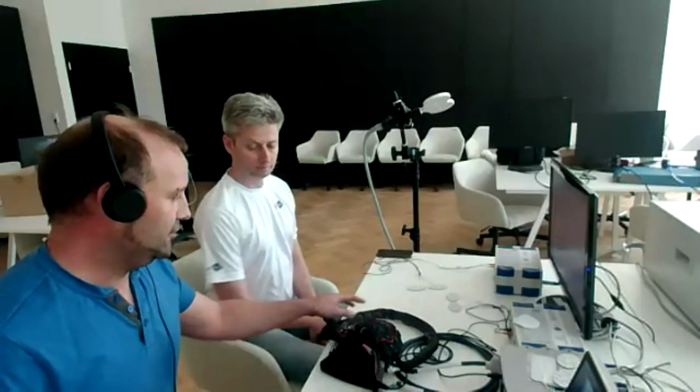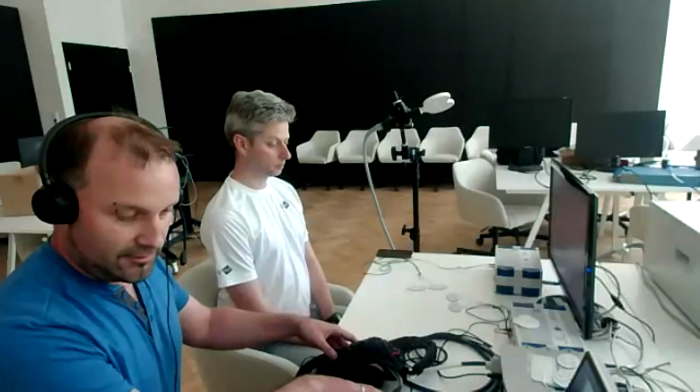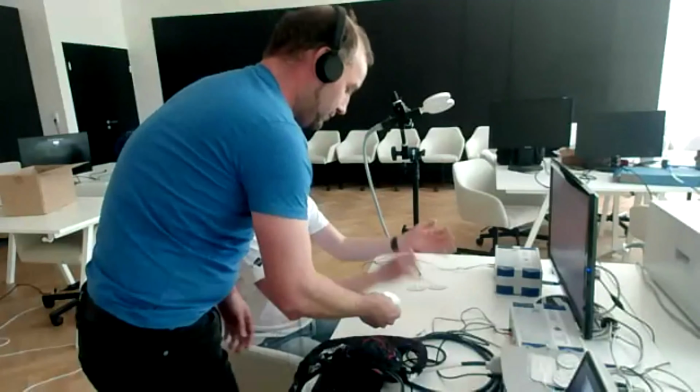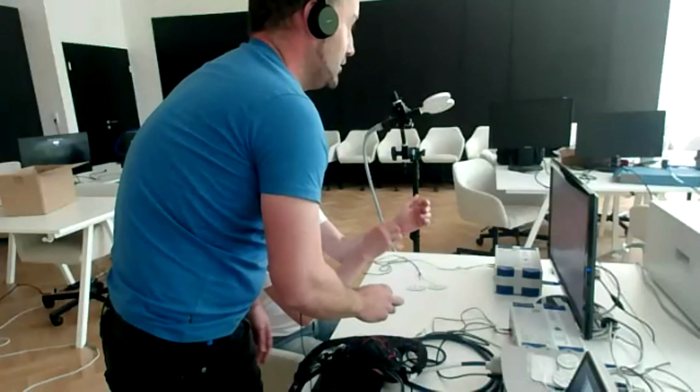So what I will do now is first I will mount the FES electrodes. So he's simply putting his hands on the table. And I am cleaning a little bit the skin also on both sides. And we have here our electrode pads. These are the ones that we use for the upper limb stimulation. So Evgeny, please make a movement of your wrist so that I can feel the muscle.